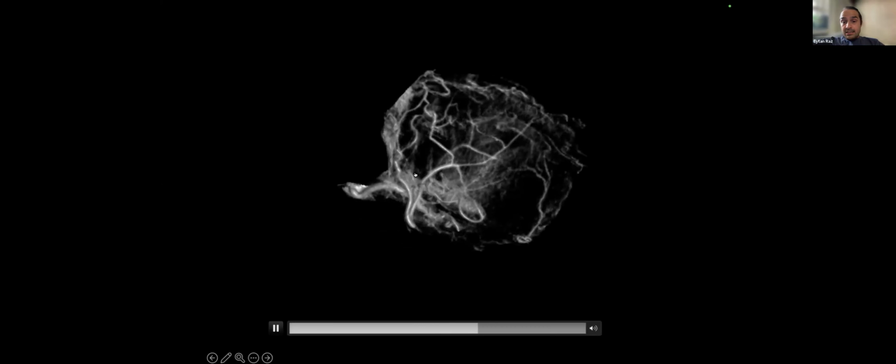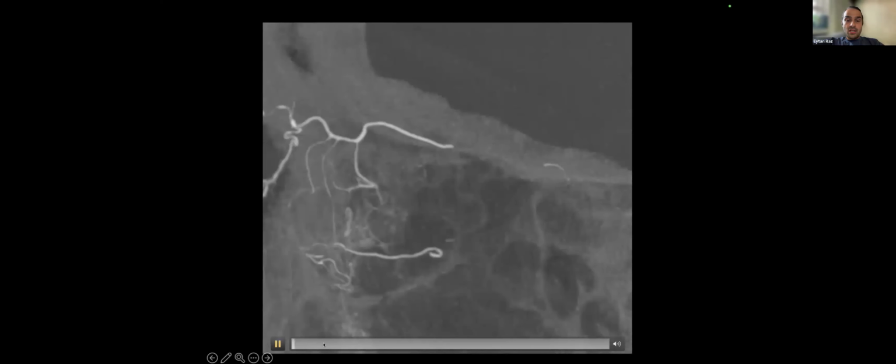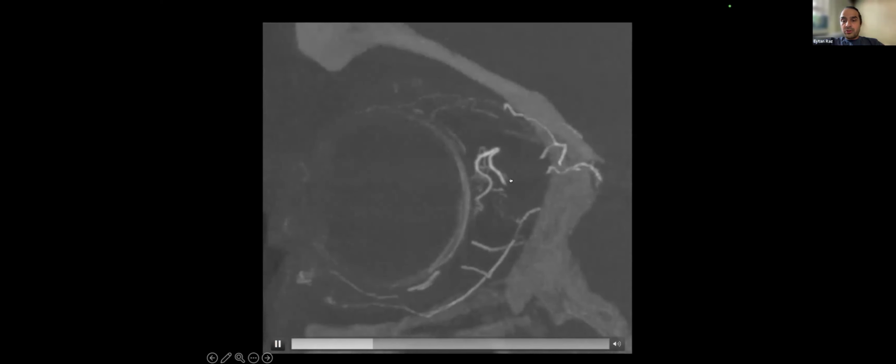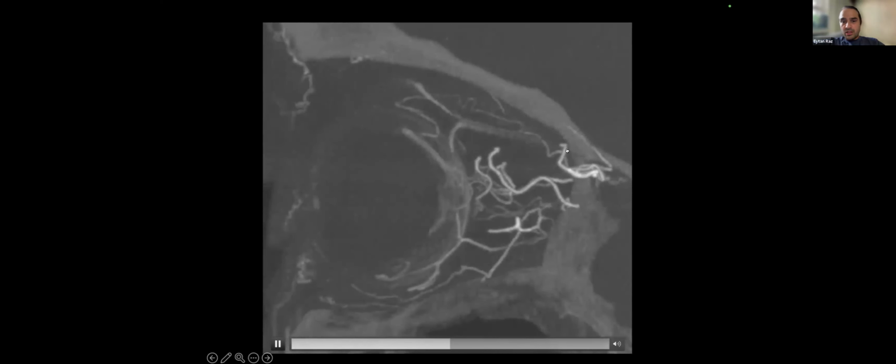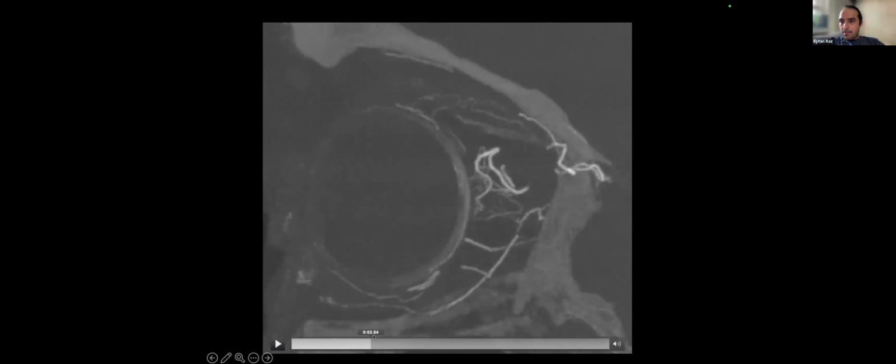This is an RT skew, so the image you're seeing is... actually I did both a 20-second and a 5-second, because the 20-second was very much artifacted with venous contamination. So I decided to do the 5-second, which is this one. With secondary reconstruction, even the 5-second injection with the RT skew and a good secondary reconstruction shows details very, very well. Not necessarily is the longest protocol always the best, because you also want to avoid venous contamination.